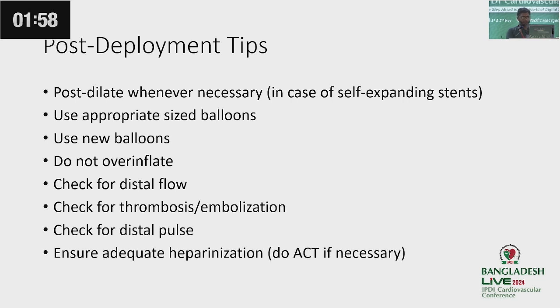Check for distal flow after the deployment. Check that distal flow is okay. Check for any embolization or new thrombus formation. Check distal pulse after the procedure. Ensure adequate heparinization. Do ACT if necessary.